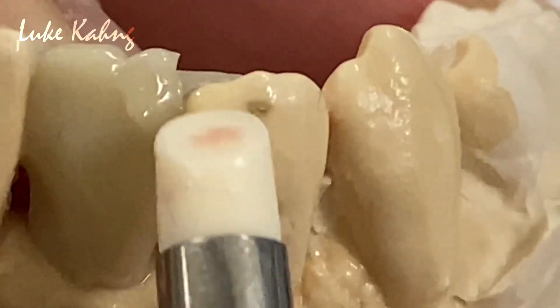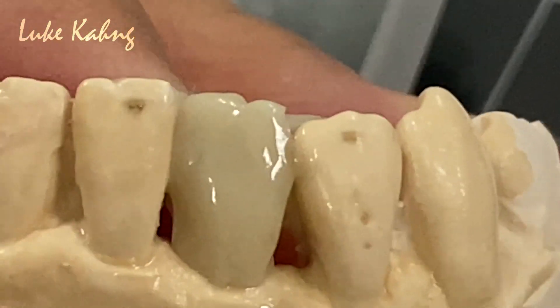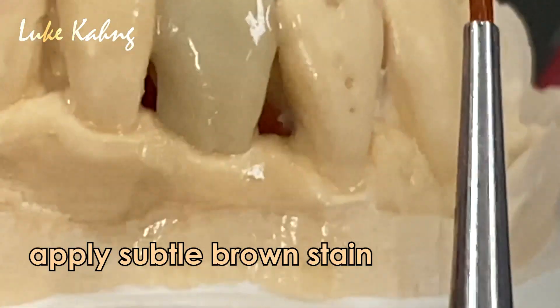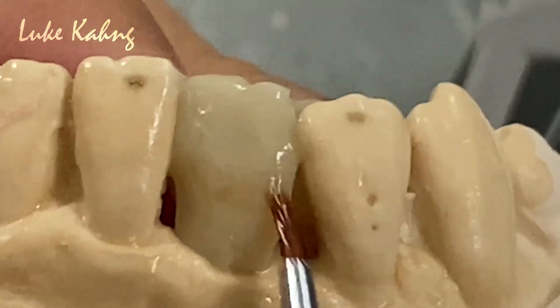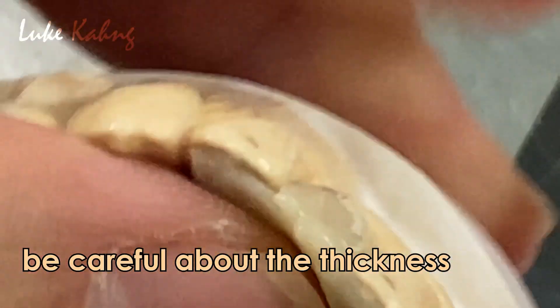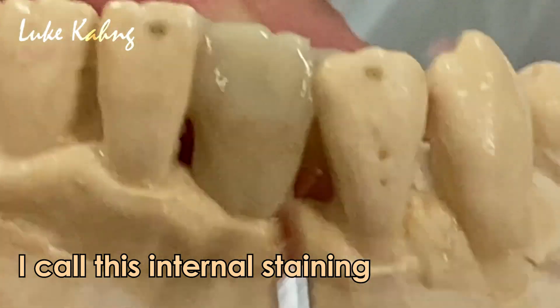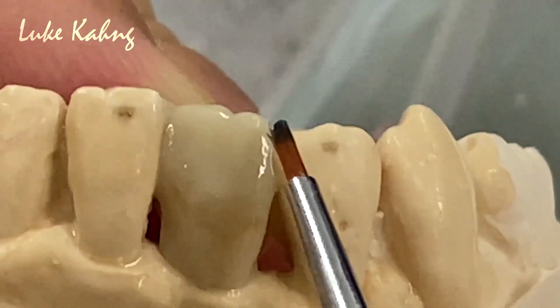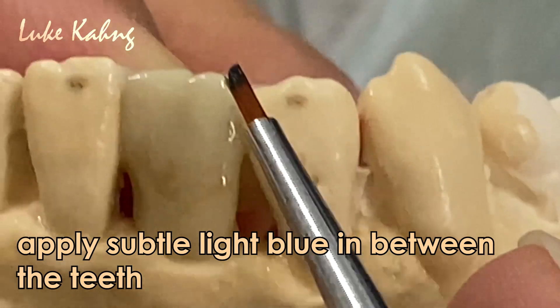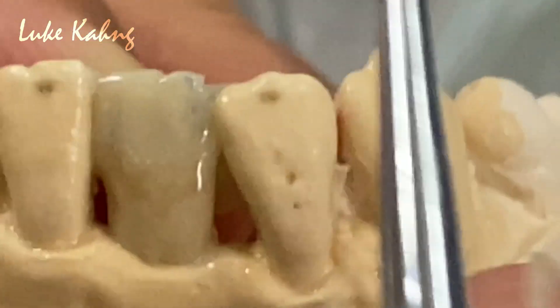So here, just put a little bit more. This was good. And then I'm using the stain — just like other color I see here, applied a little bit. The fine brown stain, very subtle. We have to be really careful about the thickness of the size. I don't want to make the tooth out. I call this internal staining from inside, compared to the patient's picture. And then I utilize light blue — very subtle in between teeth, you see. I don't want too much — if I put too much then it's not good, so I take it out.